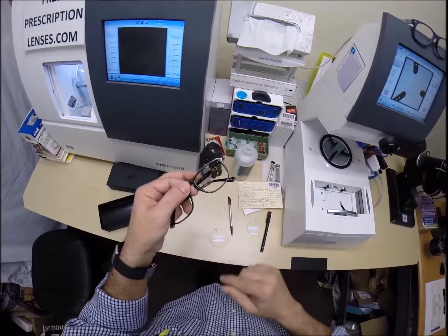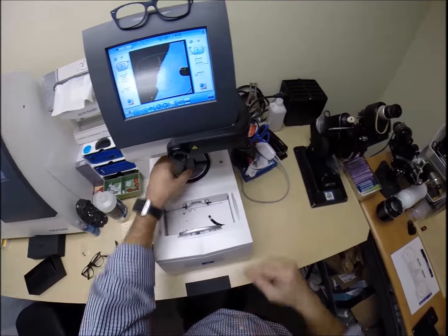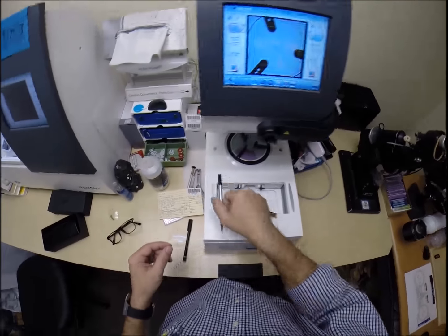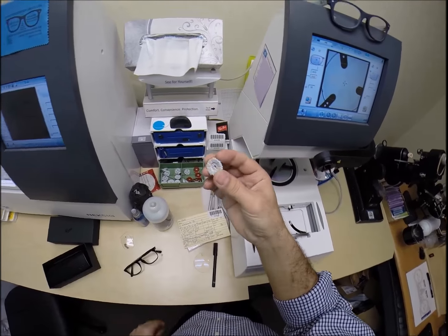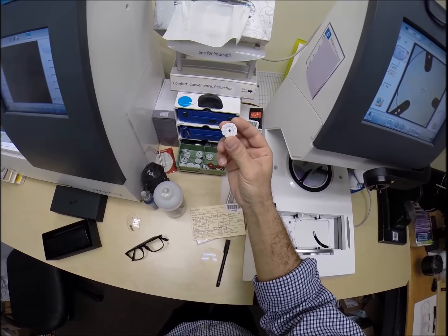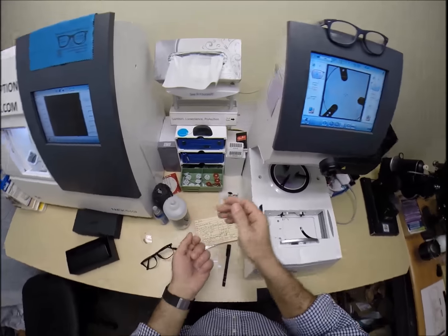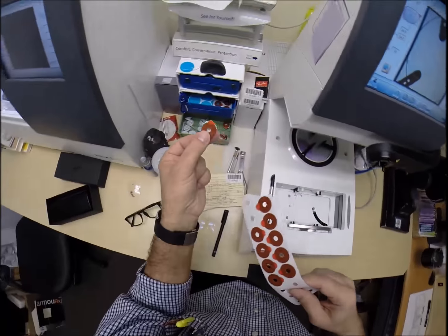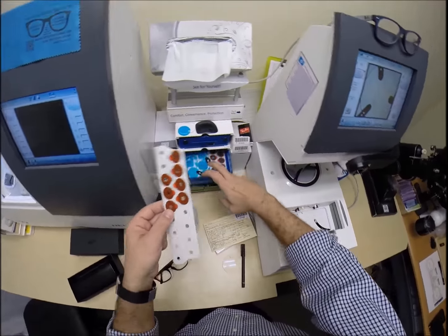Now Dale knew his pupillary distance - that's the distance between your eyes - but he did not know the height of where the invisible bifocal should begin. So we in the industry use a pen when sitting across from someone. We take a marker and put a dot directly in front of your pupil. So I had him do that as well, and I measured where the height will be.